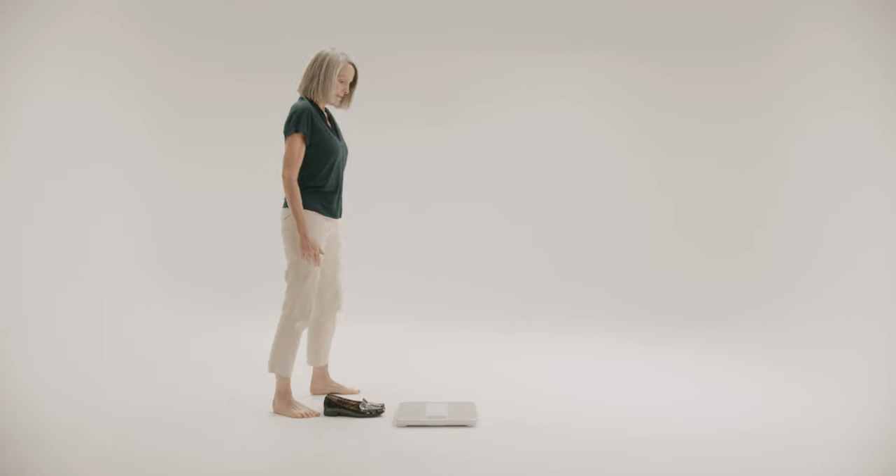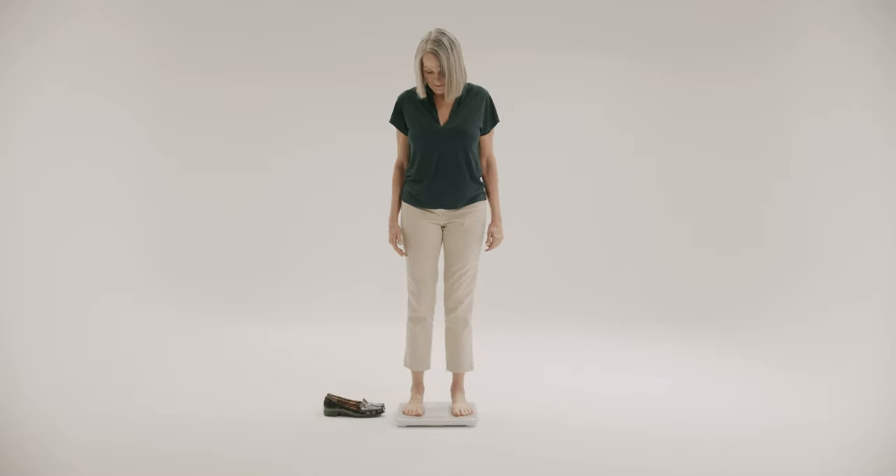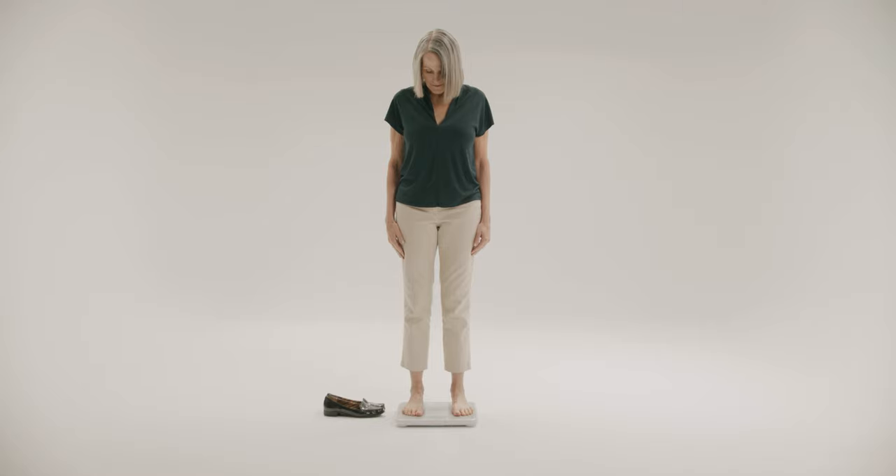Step on the scale barefoot. The device will power on. Stand still and keep full contact with the scale. Maintain your balance on the scale and try not to sway to obtain an accurate reading.